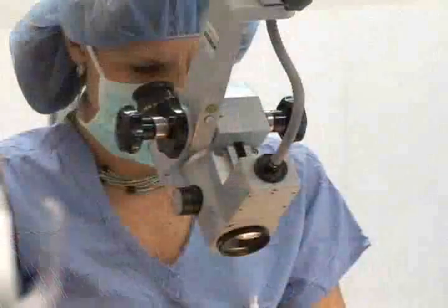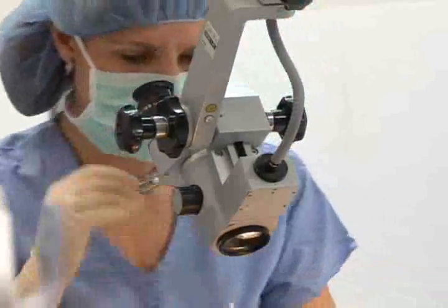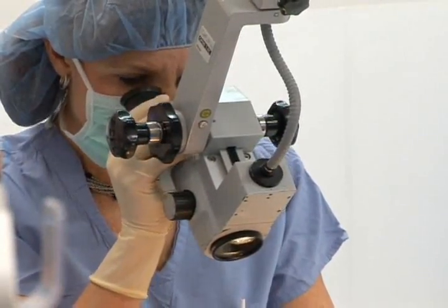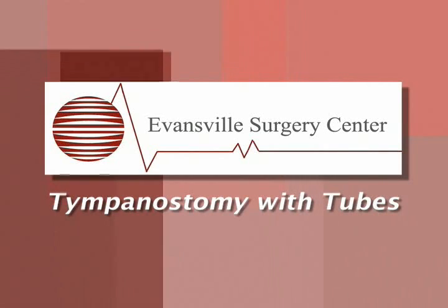The tube is then placed, and as you can see, there is a hole in the middle of the tube. All tubes have some kind of hole in the middle of them, and this is in order to aerate the space behind the eardrum to avoid reaccumulation of pus, mucus, or fluid. Then drops are placed and a cotton ball is placed, and that ear is complete. This whole process really takes approximately 5 to 10 minutes, depending on how much wax or other debris may need to be removed from the ear canal prior to placing the tubes.